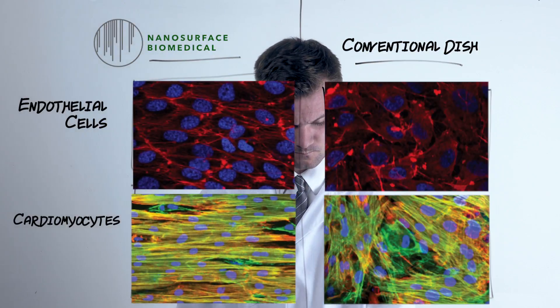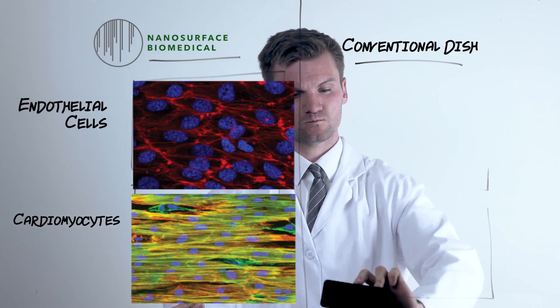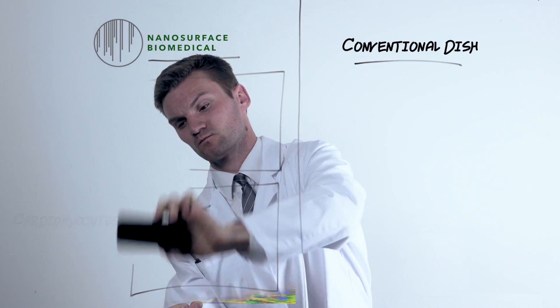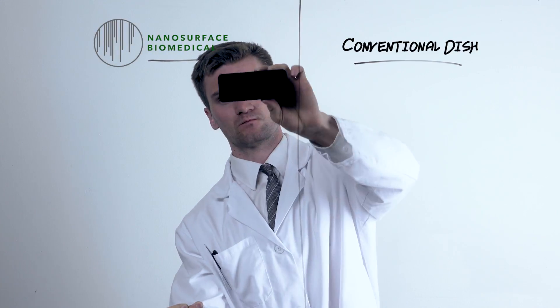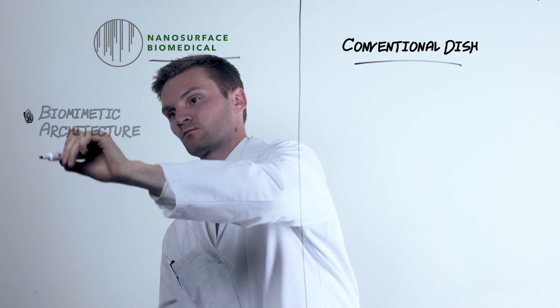Cells cultured in nanosurface dishes are structurally more physiologic and are phenotypically more mature. In conventional dishes, a culture period of three months to a year is required for the development of adult cardiac features. In nanosurface dishes, similar maturation can be achieved within only a few weeks, saving time in the incubator and money on reagents.